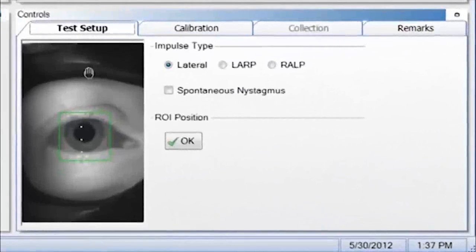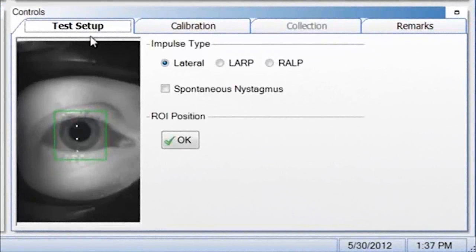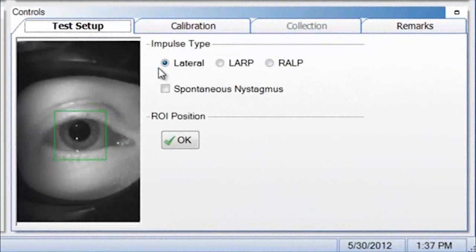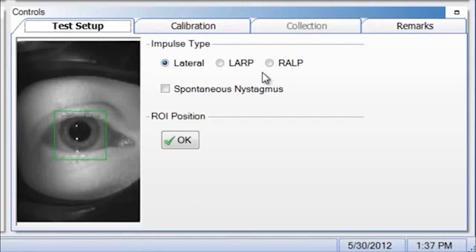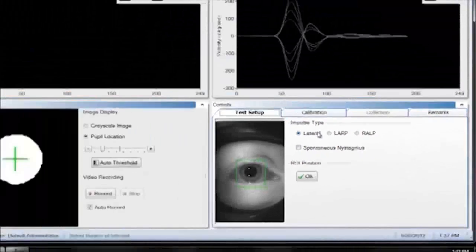To begin the test, you're in the Test Setup tab. You want to first select the impulse type: Lateral, LARP which is left anterior right posterior, or RALP which is right anterior left posterior.